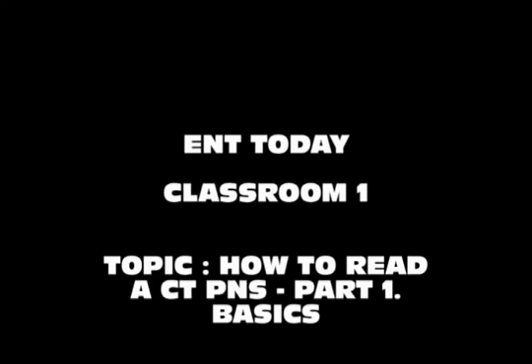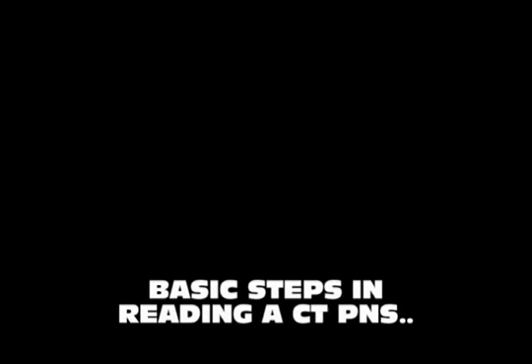Hi, this is Dr. Janikaram from India, and we are going to start ENT Today classroom. The first topic of discussion would be how to read a CT scan basics. This is part 1. Basic steps in reading a CT scan paranasal sinuses.